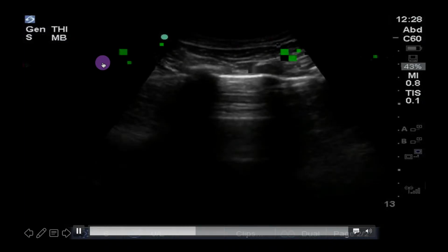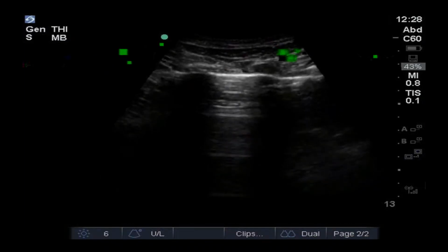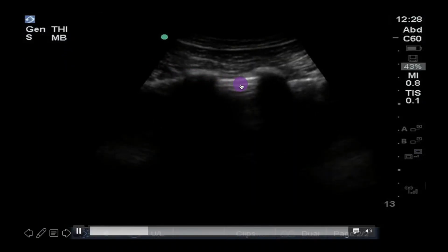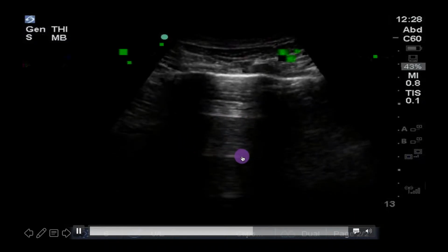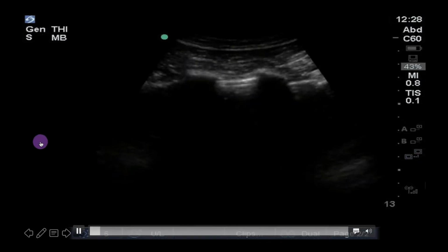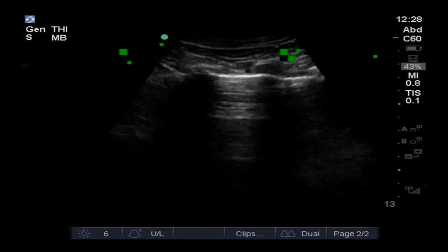The closer to 90 degrees the path of the ultrasound beam is between the two reflectors, the clearer the artifact will appear, and more A-lines will be seen deep to the true pleura. This is what is shown here. By adjusting the angle of the ultrasound transducer, we are able to make A-lines appear in greater numbers and more clearly.